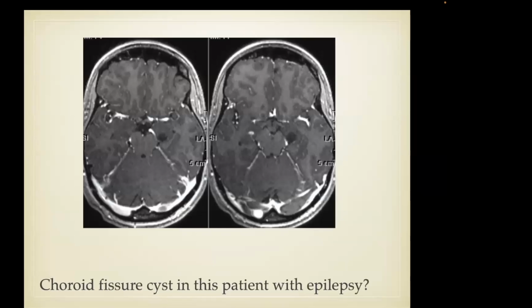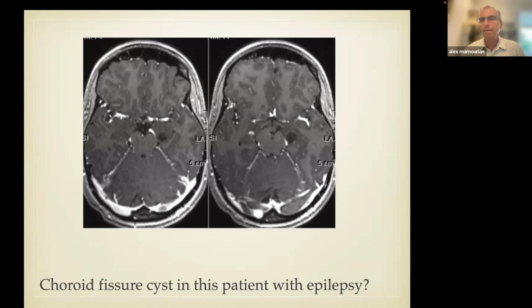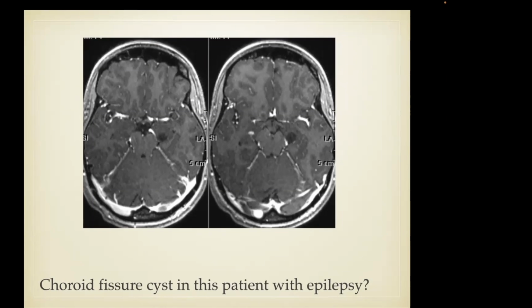Very sorry, I'm terribly sorry. Can I ask one more question? If we need to check for meningitis or for subarachnoid space, in some literature I found that they use T1 FLAIR, not T2. What do you recommend? Is T2 FLAIR more sensitive, or T1 FLAIR?